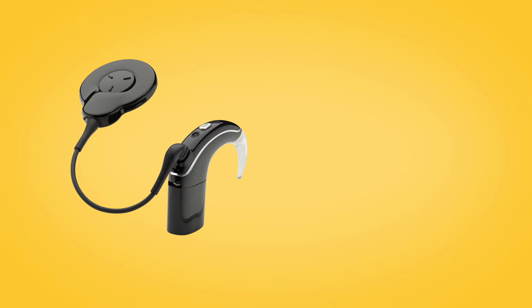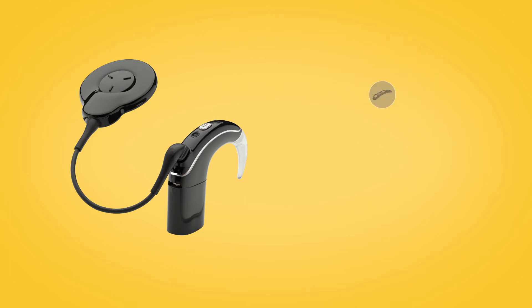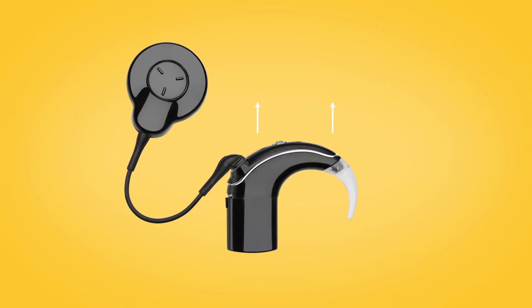Microphone protectors are built into the Nucleus 7 microphone cover, which is completely replaced. First, you need to remove the old microphone cover.